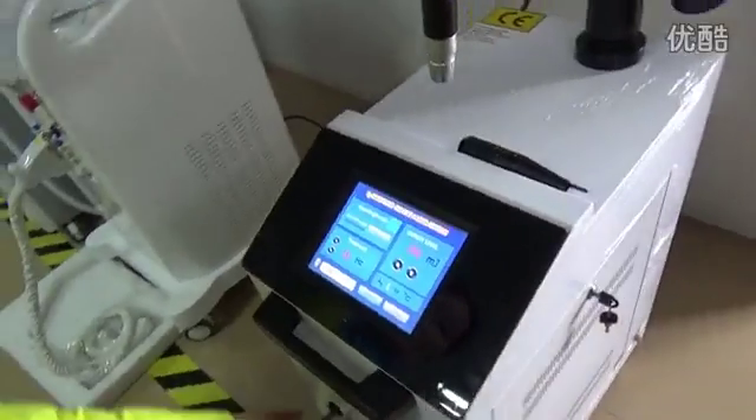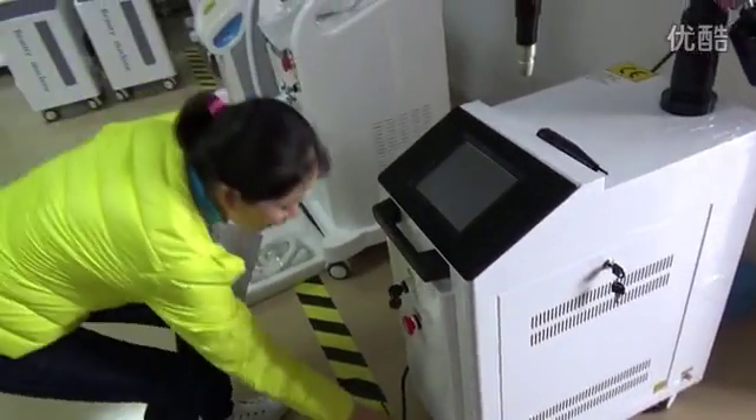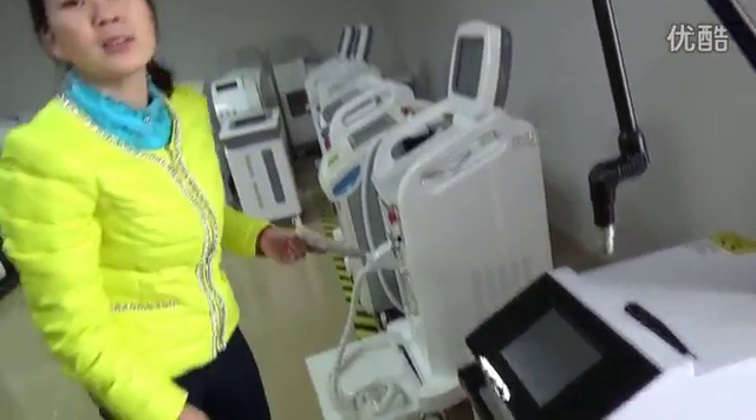After the treatment, turn off the machine and pull out the power cord. That's all.